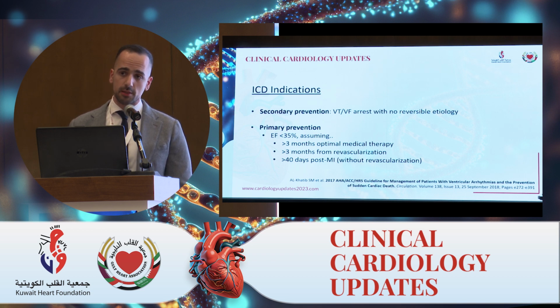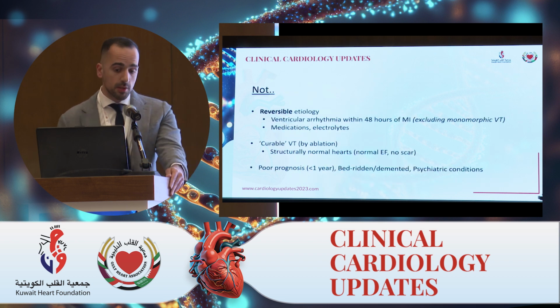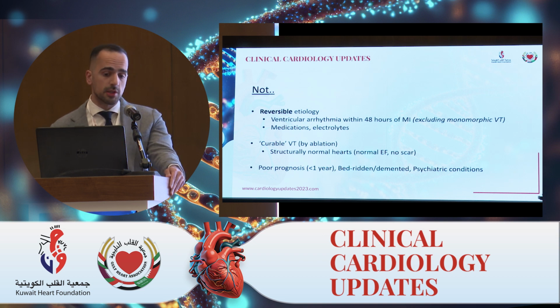When it comes to ICD indications, as I said, these are tachy devices. We implant these to protect the patients from life-threatening arrhythmias. Those who have already suffered such an arrhythmia and recovered with no reversible etiology identified qualify for these devices on a secondary prevention basis. But we also implant these as a primary prevention device in patients who we know are at increased risk based on numerous studies, but usually patients with a reduced ejection fraction who have been optimized on medications and revascularized with no significant improvement in EF beyond 35%. Again, it is very important to make sure there is no reversible etiology.